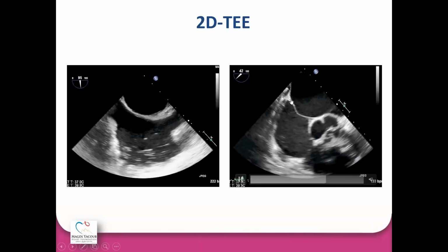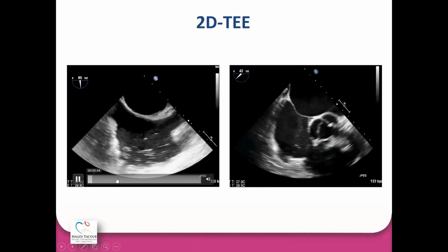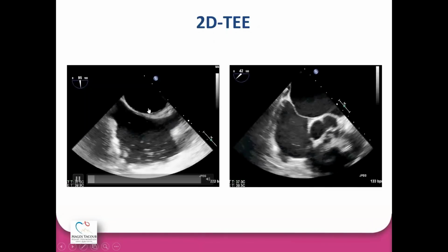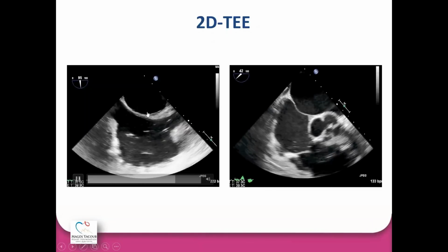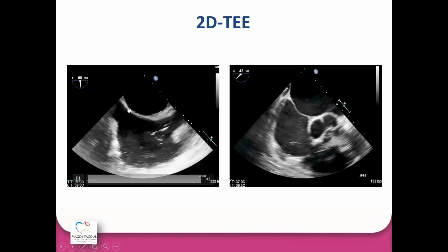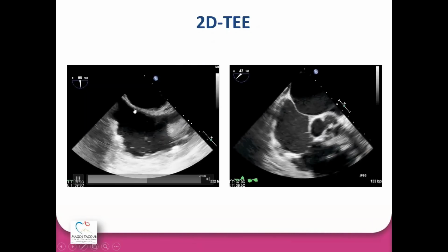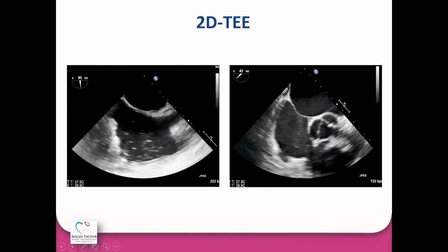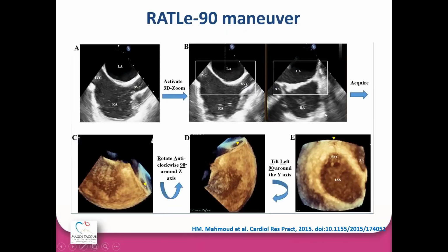So we have to be in the posterior part of the septum, but from the superior-inferior aspect, some procedures like the MitraClip will need to be in the superior part of the septum. Other procedures like the left atrial appendage closure or the mitral balloon valvuloplasty need to be in the inferior part of the septum. By 3D-TEE, we will get the anatomically oriented view for the live guidance of the septal puncture.